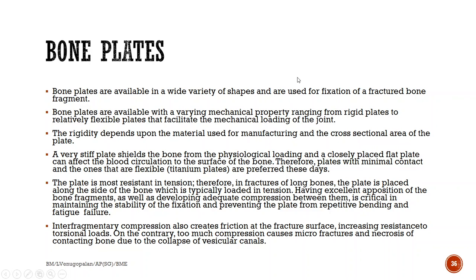If there is too little compression between the fragments, then that would increase the torsional load, and if there is too much compression, then that can lead to microfracture and also necrosis of bone tissues, because it will collapse the vascular channels. So the cells of the bone would die because of too much compression.